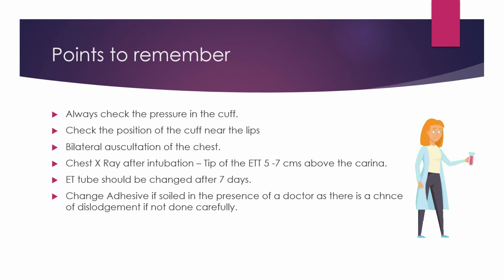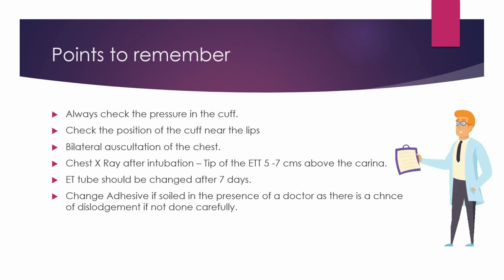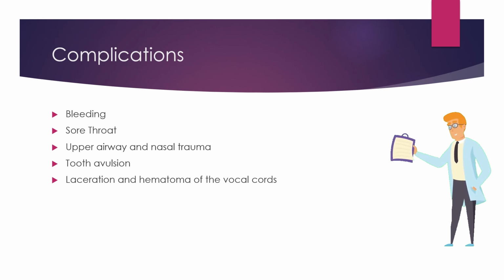Okay, and if the adhesive is soiled, which can happen because of the secretions, when you're changing the adhesive, it is very important that you do it in the presence of a doctor, because there is a chance that the endotracheal tube can get dislodged.